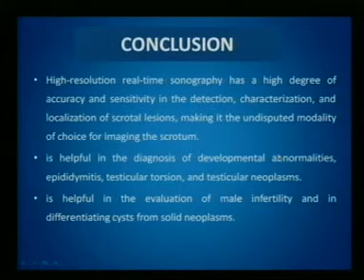In conclusion, high resolution real-time sonography has a high degree of accuracy and sensitivity in the detection, characterization, and localization of scrotal lesions, making it the undisputed modality of choice for imaging of the scrotum. It can differentiate different pathologies, tumor, non-tumor, acute cases, and is involved in the investigation of infertility.